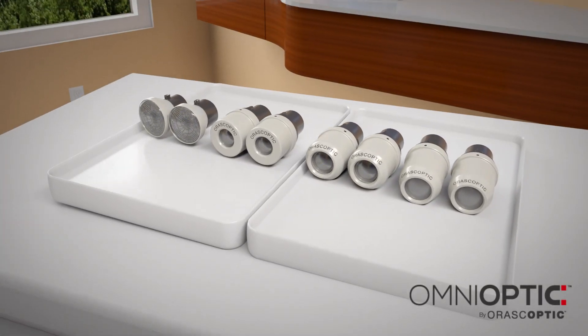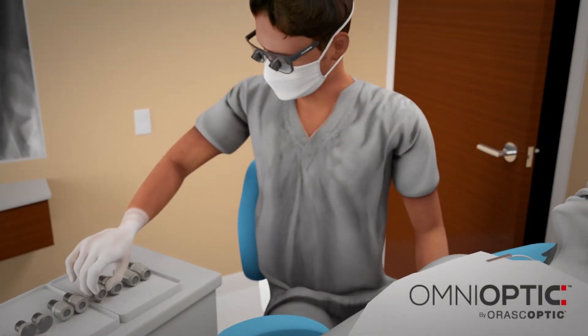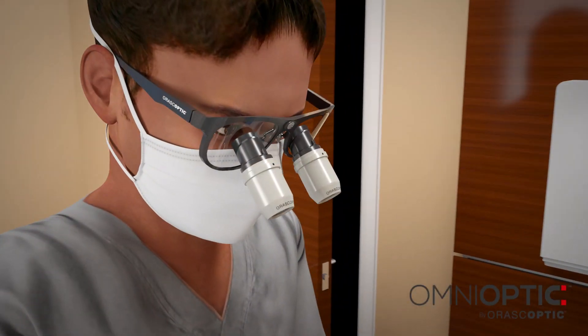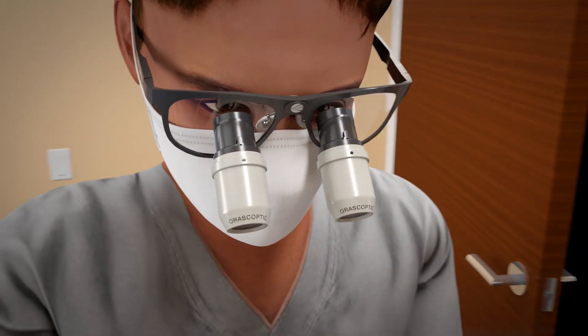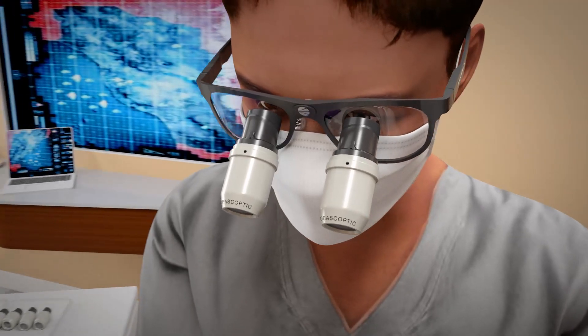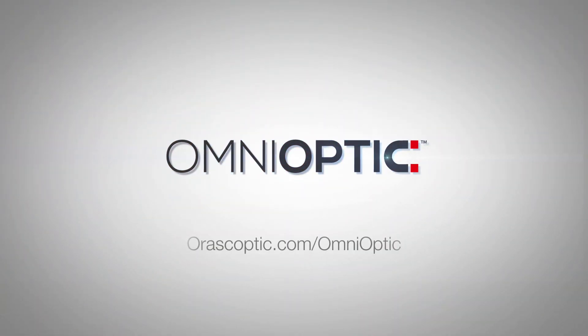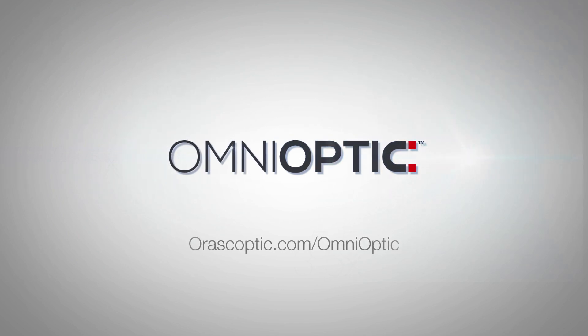Interchangeable telescopes allow the user to select the ideal magnification for each procedure. Gradually increase your magnification power throughout your career without investing in multiple pairs of loupes. Discover the power of interchangeable magnification at Orascoptic.com/OmniOptic.